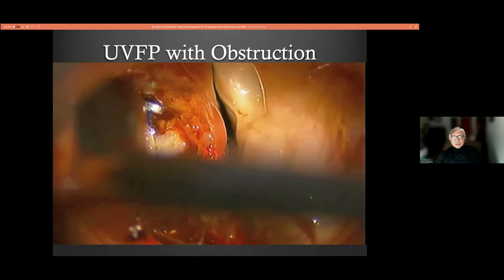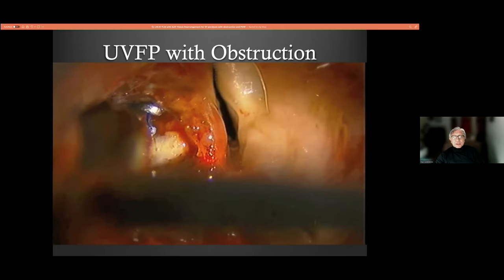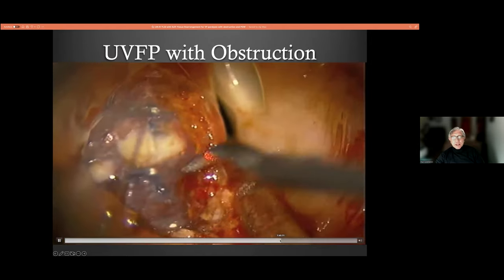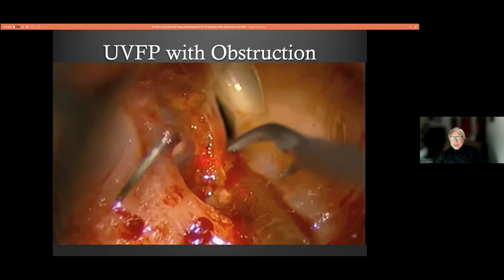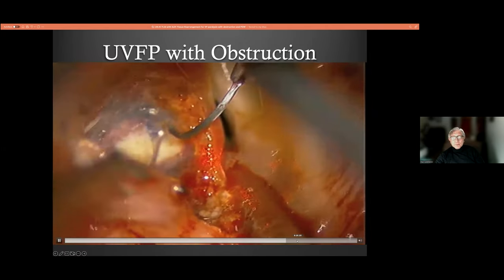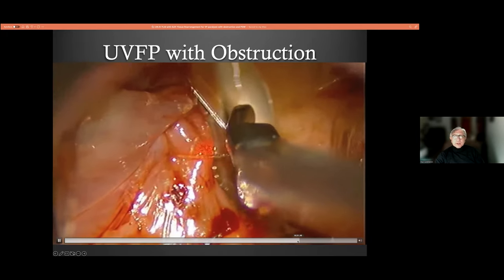And then I put clips on the sutures holding the graft in place, and I put clips on the sutures lateralizing the arytenoid in patients who need that. This patient did not need as much lateralization as she needed this to be removed so she could breathe and then give her a better voice. And this is the clipping.